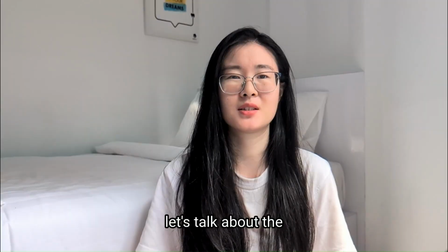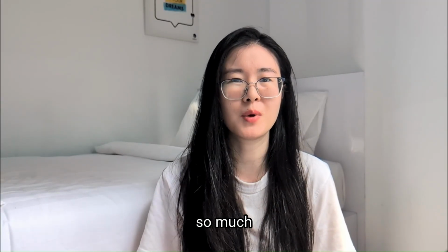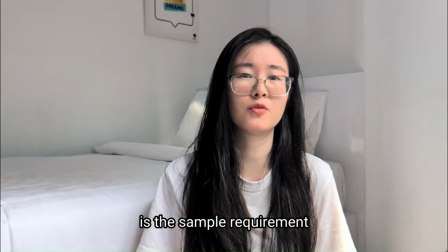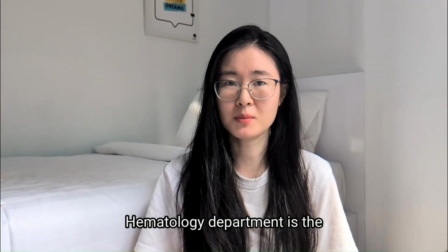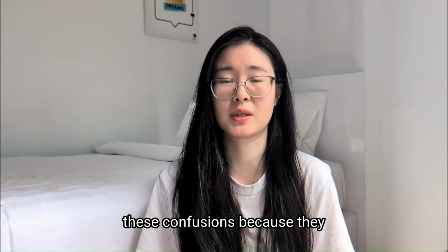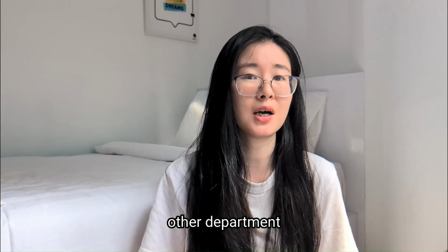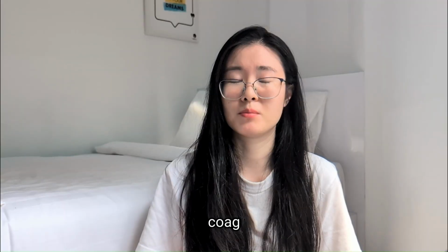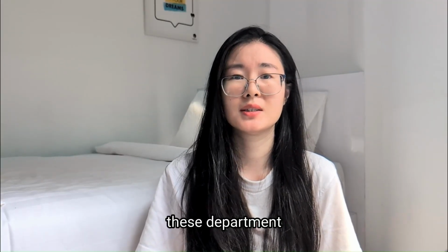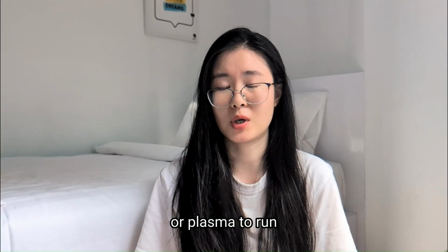And last, let's talk about the one that confuses so many doctors and nurses: the sample requirement for whole blood versus serum. The hematology department is the only department that doesn't have this confusion, because they use whole blood for testing. But every other department, coag, blood bank, or chemistry, uses serum or plasma to run the test.